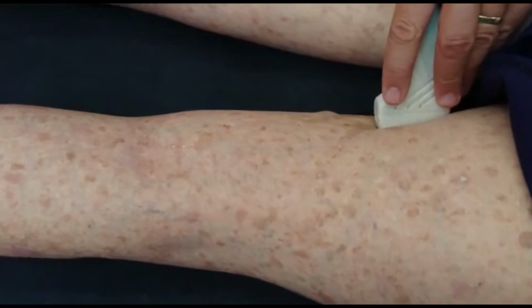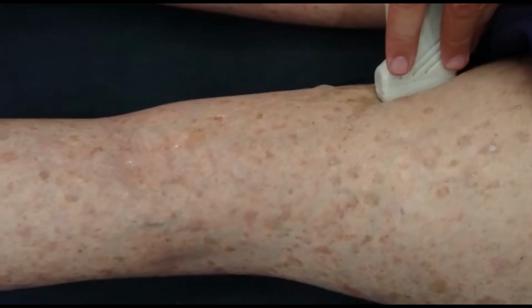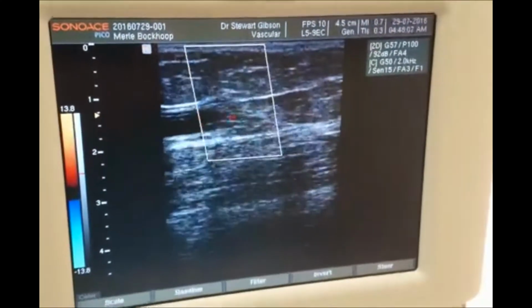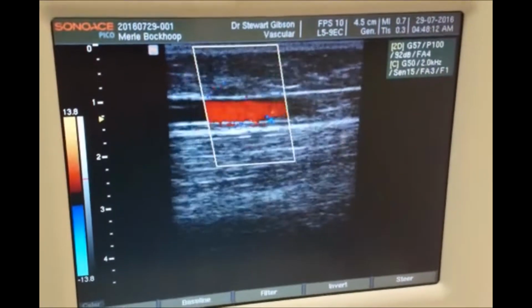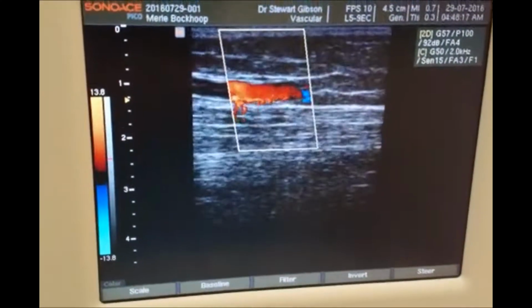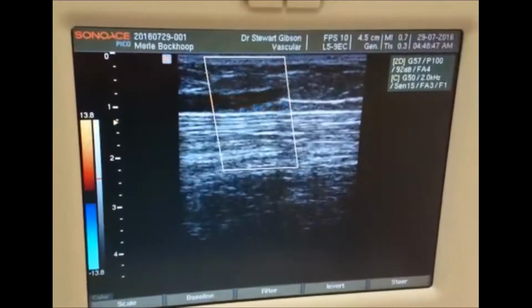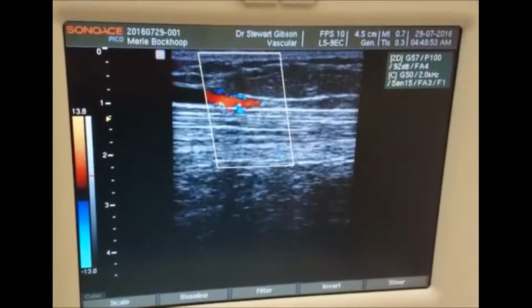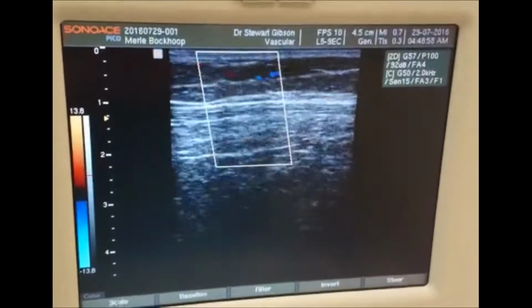Right, we're looking back on the right leg, this time with the patient prone, and you can clearly see the great saphenous vein below the Hunterian perforator. It starts to become pulsatile. At this point, we're actually tracing this vessel posteriorly. You'll notice that there is a bifurcation, the one going to the medial aspect of the calf and the other one going posteriorly to the calf.